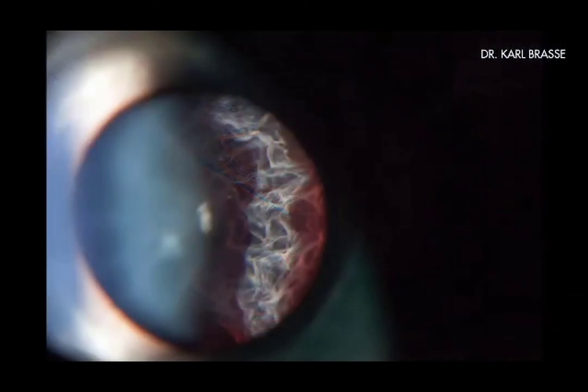Let me finish my presentation, and in particular the Group 5, with a spectacular case which you might have never seen before. We are looking at the left eye of a 22-year-old patient. She came for a second opinion and was complaining of a massive impairment of visual acuity. That young lady had already an appointment for a vitrectomy. This slitlamp image reveals the diagnosis of an ocular amyloidosis. Systemic amyloidosis could luckily be excluded.